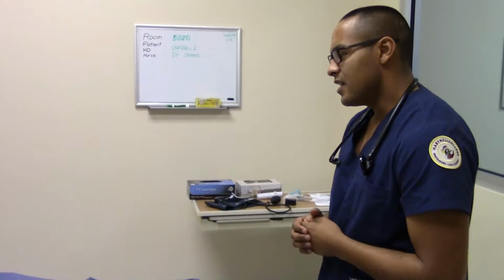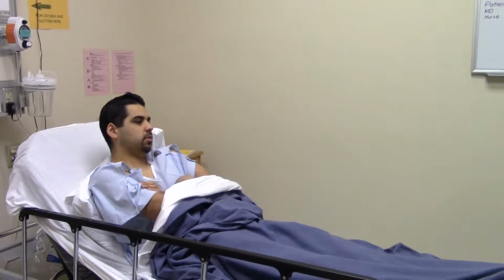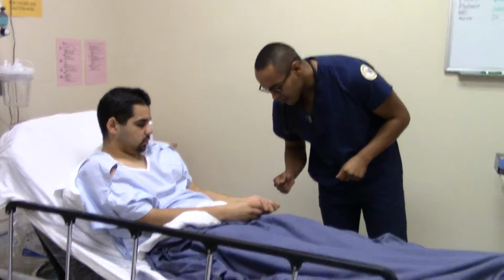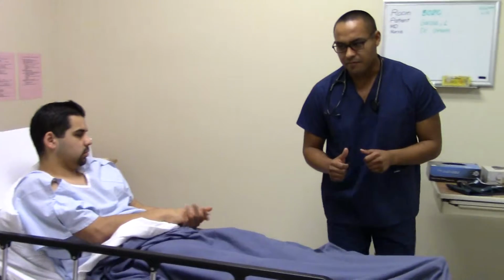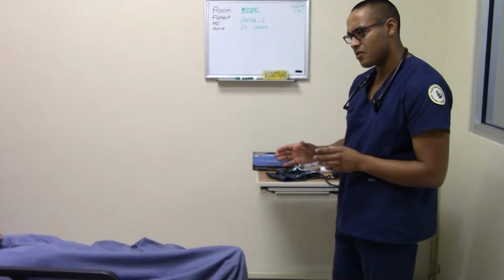Hello, my name is Race. I'm a respiratory therapist student. Can I get your first and last name, please? Yeah, Christian Galvin, 52591. Okay, thank you. Your doctor ordered an SVN treatment. This is a small volume nebulizer. Have you used one before?